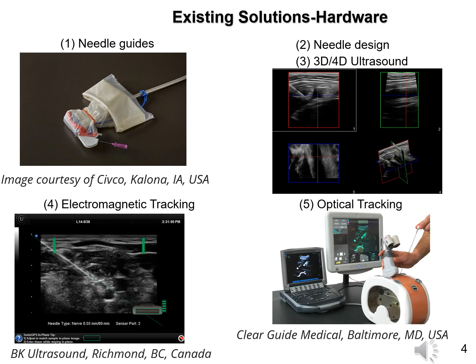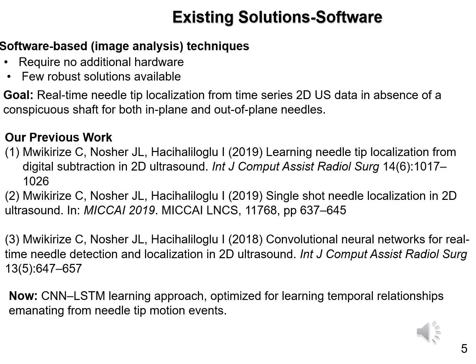Then we have optical and electromagnetic tracking systems, which sometimes have large errors, disrupt the normal clinical workflow, and are also very expensive. Instead of using external hardware for identifying and displaying needles and their trajectories, software can detect needles using advanced image processing algorithms. There's a lot of literature out there on image analysis-based methods, but finding the most efficient approach that is robust enough is still an open question. And most of the recent work focuses on the use of machine learning.